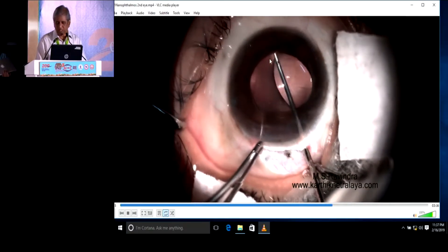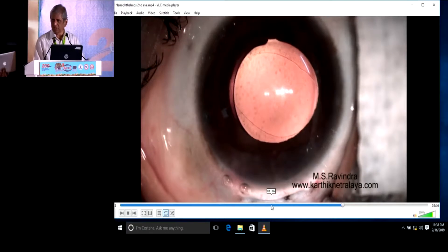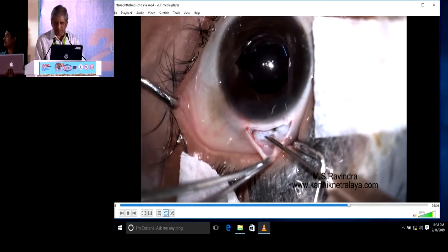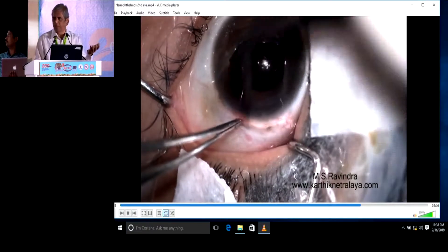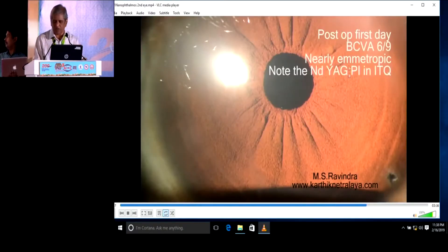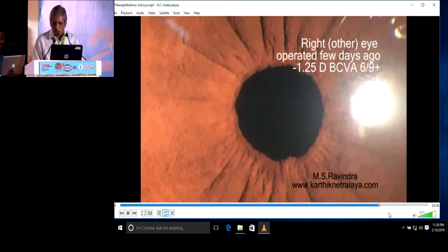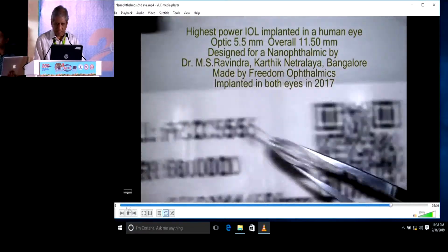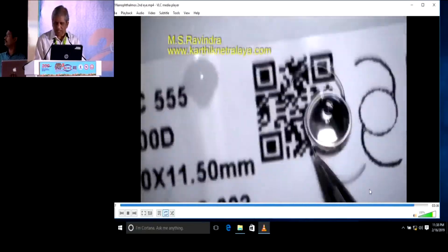That's a PMMA lens. I went to the IOL lab and sat with the technician and developed this lens. Initially it was trial and error. Ultimately, we could develop a couple of lenses of 60 diopters, implanted in both her eyes. PMMA lens is a little tricky to push into the capsular bag in a small eye like this, but I could achieve it. No sutures. Astigmatism in this patient was zero. This patient was wearing a plus-20 contact lens with correcting spectacles on top of it. She had 6/9 vision, which she had never seen in her life. The lens has a diameter of 5.5 mm and an overall diameter of 11.5 mm instead of the usual 13.5 mm — a small size lens, made in India.